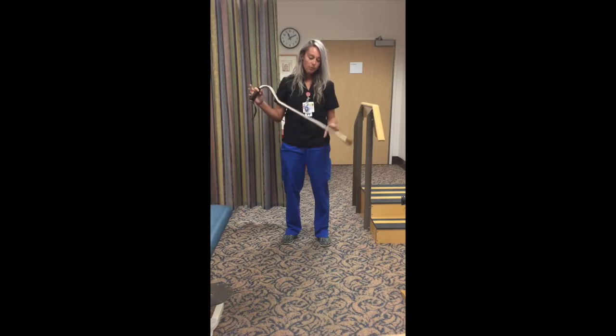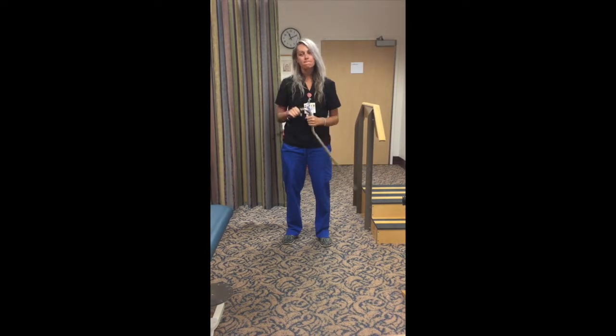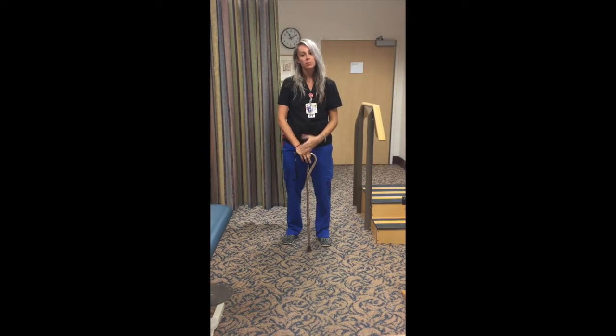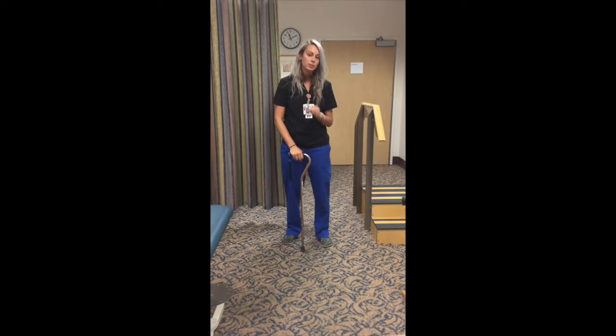Okay. Now, Christy, who makes that decision? Is it the therapist, the physician, or the patient, about when they're ready to go from walker to a cane? A lot of the times it's the patient. However, if you're still limping a lot, despite the fact that you're not putting weight through your hands on the walker, we may coach you to put a little bit more weight through your hands so that you're eliminating the limp. We don't want you to limp at all.